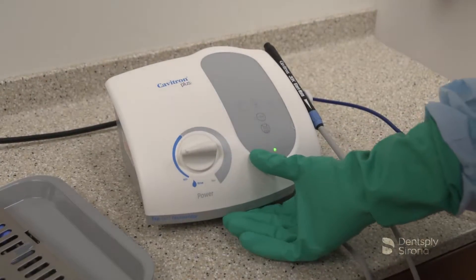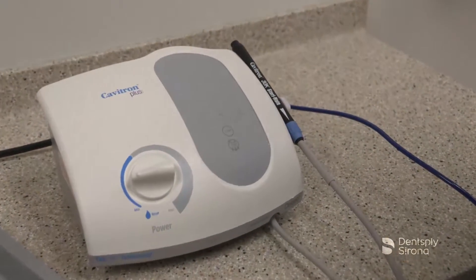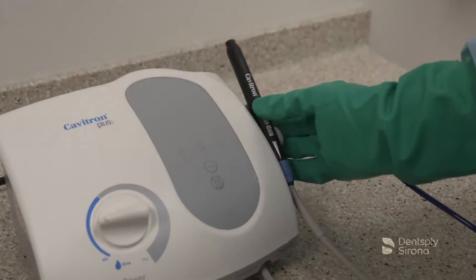After the purge cycle is complete, turn the system to the off position. Remove the SteriMate handpiece from the unit.